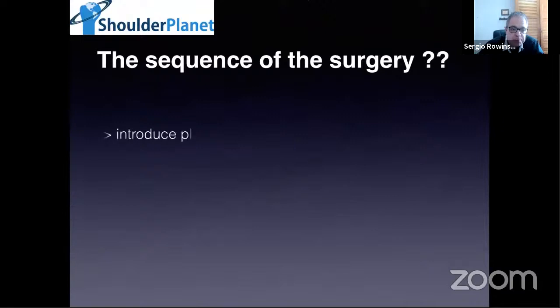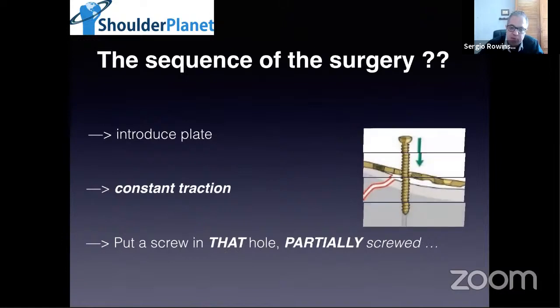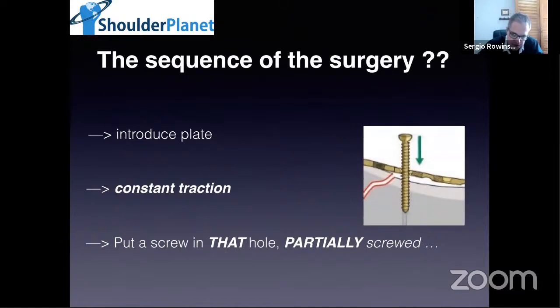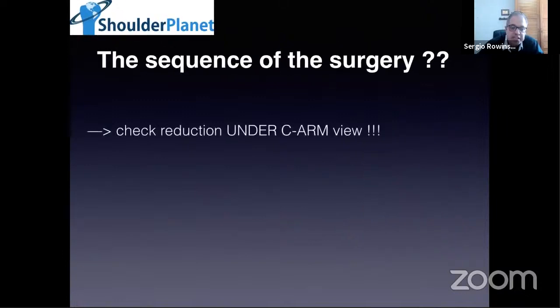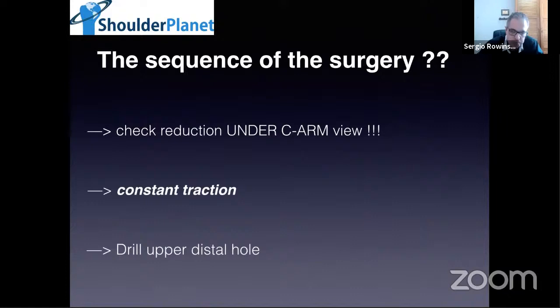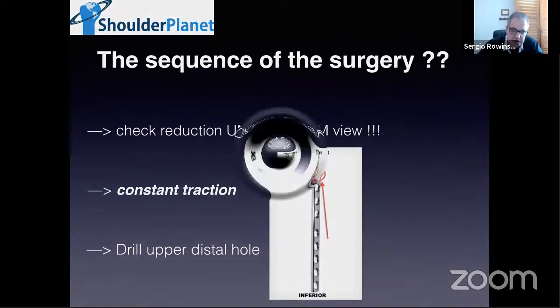After that, I introduce the plate from superior to inferior, always under traction. I put a screw in that penultimate distal hole. I go until the second cortex and I come back, and I leave it in the intramedullary canal. After that, I check reduction under C-arm, always under traction. And I'm going to drill the distal upper hole, the penultimate screw. I feel very comfortable like that.